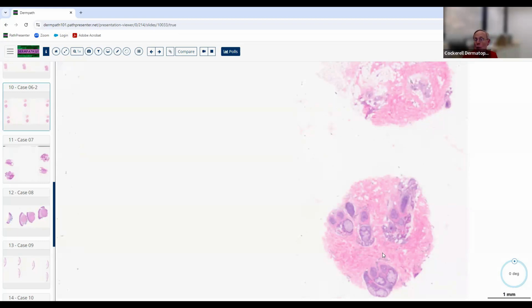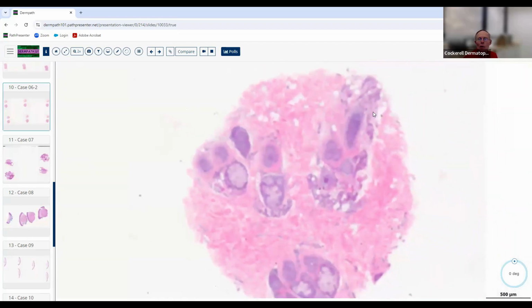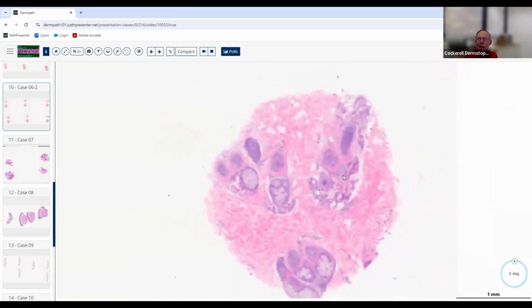Alopecia areata will turn into a billiard ball. The individual patches of alopecia areata are totally devoid of hair, and then you'll see the exclamation point hairs. You'll see the white hairs, which are more resistant to the inflammatory reaction. So you can make the diagnosis here even without any peribulbar infiltrate. Even though it's out of focus and fuzzy, we can still make the diagnosis just based on the fact that it's all synchronized like that. So good, very, very good.